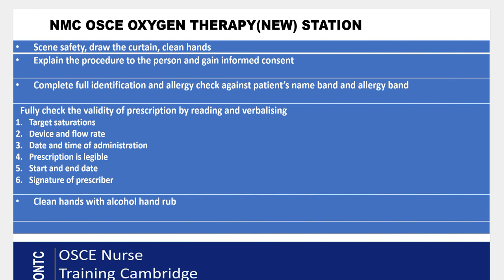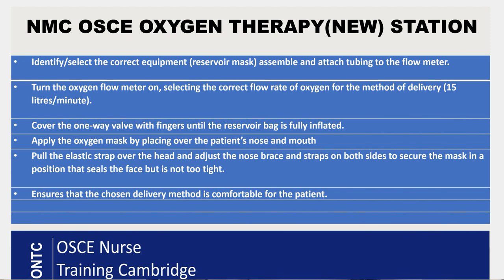Once you have confirmed the prescription is complete and valid, clean your hands with alcohol hand gel. Then identify and select the reservoir mask from the collection of masks provided — the reservoir mask comes with tubing already attached. Attach the other end of the tubing to the oxygen flow meter, whether it is on the wall or a cylinder. Turn the flow meter on and set the correct rate of 15 litres for high flow oxygen delivery.